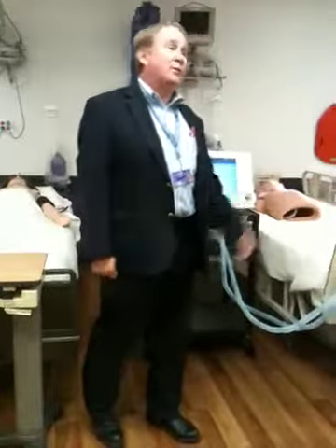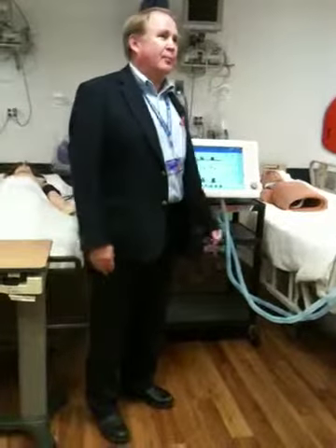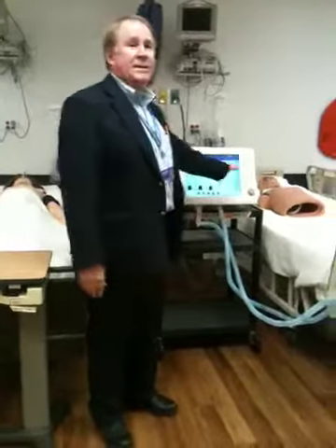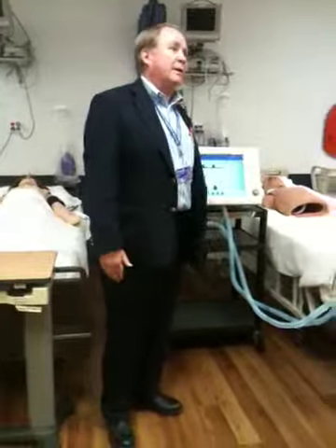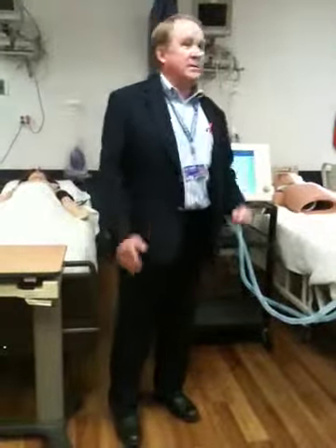Was there an alarm while I was gone? Nurses call and say, oh, it was alarming, I reset it. I need to know what was alarming. I can go back in and say I want alarm history, and bingo, I've got the alarm history. I know exactly what time it was, what took place, and I can then correct the situation. But we'll be working with all of these.